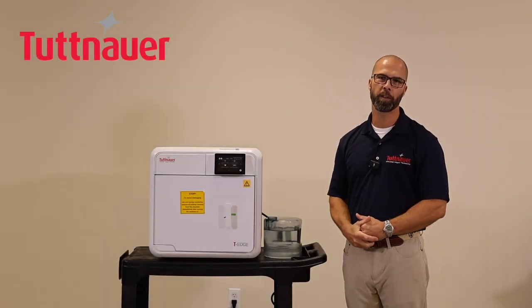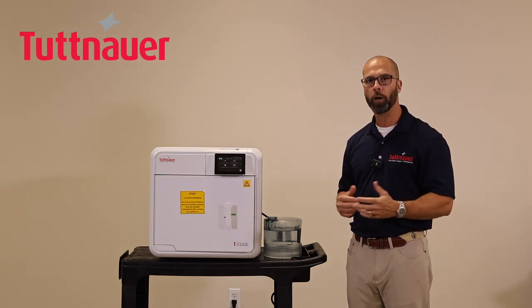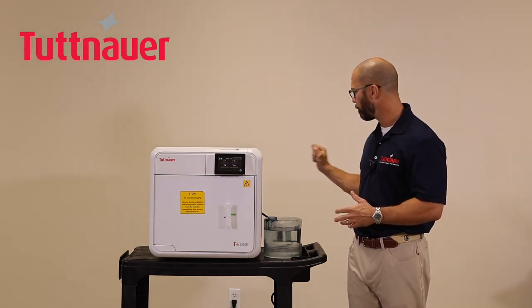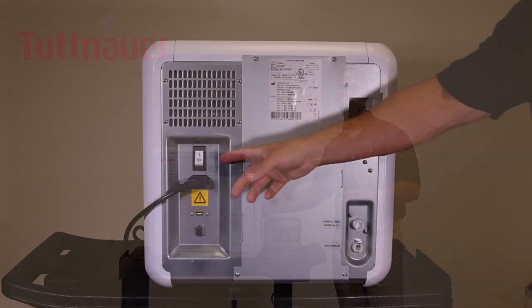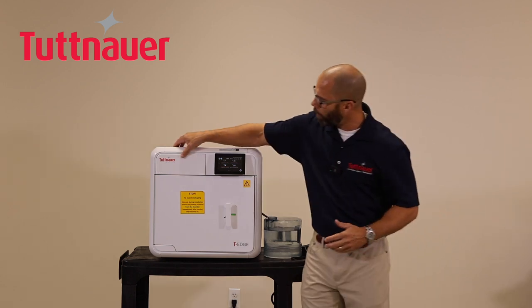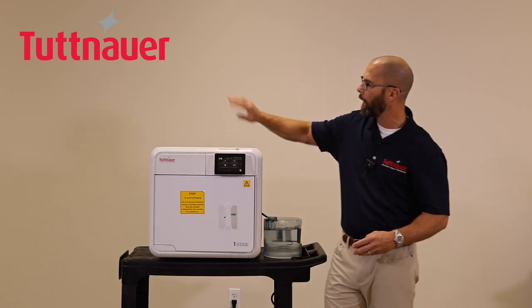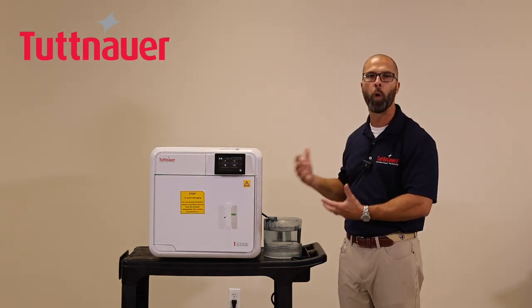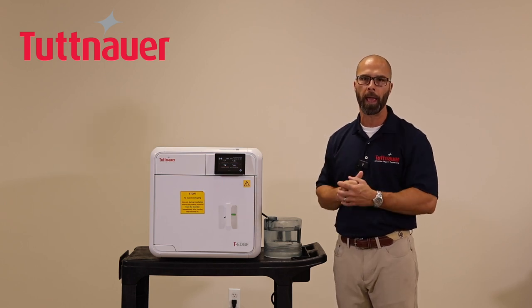With the machine placed on a countertop and plugged into a dedicated 115-volt 15-amp circuit, there is a semi-automatic on/off switch on the back that acts like a circuit breaker — this always stays in the on position. The main power switch on the front is what you turn on and off each day. When you turn it on, you'll hear the machine start to warm up as various components heat up and prepare for operation.